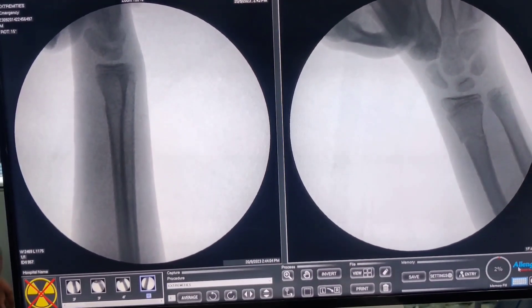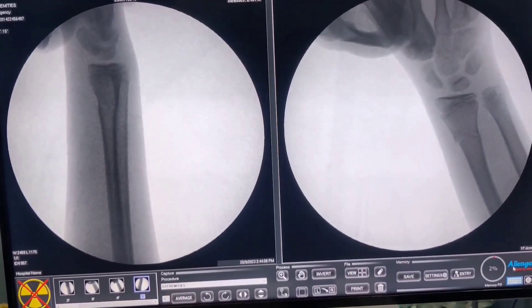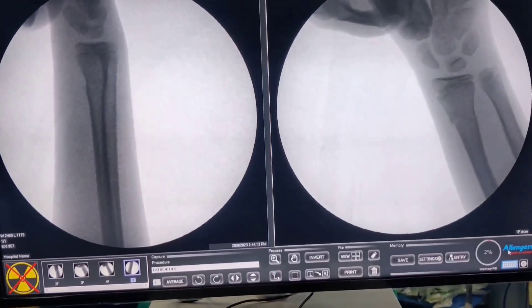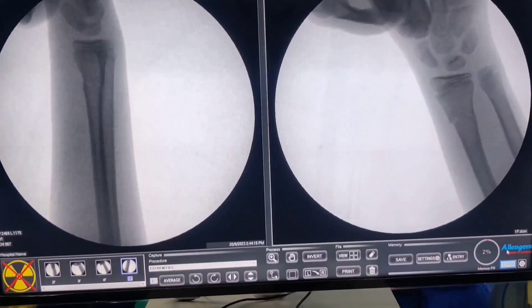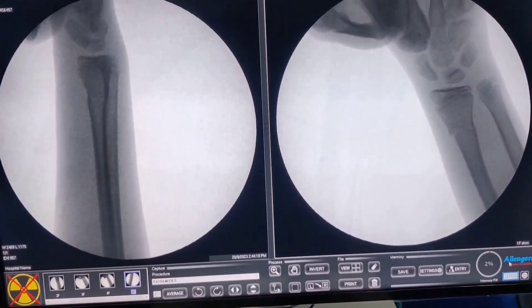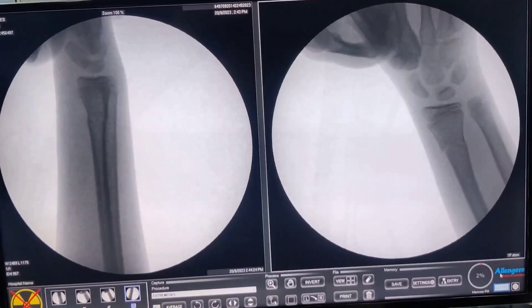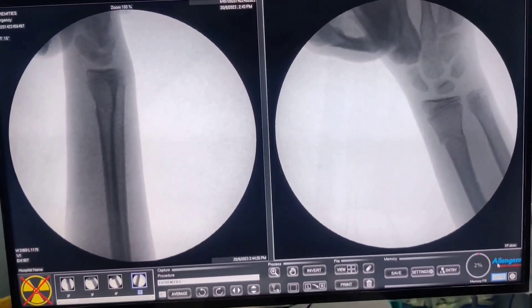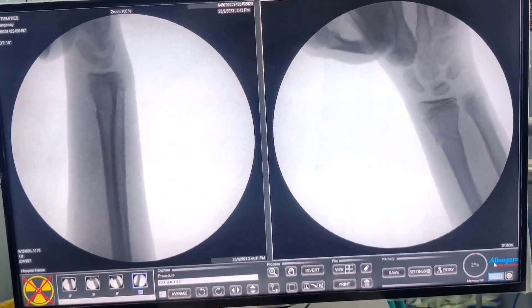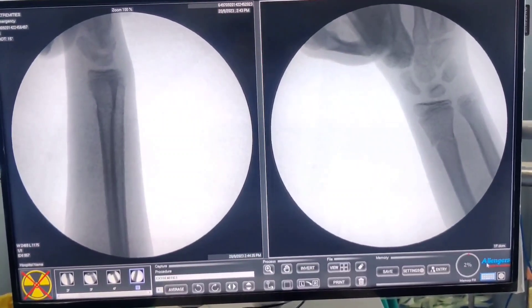These are the images after 2 to 3 minutes of traction and counter-traction and you can see everything has fallen back in place — this looks beautiful. However, as soon as I let the traction off, on the AP it looks okay but on the lateral it is losing its position. If I was in England I would probably treat him in a plaster as it is easier to explain there, but here I am going to pass probably one wire to secure it so that it looks perfect on X-rays.